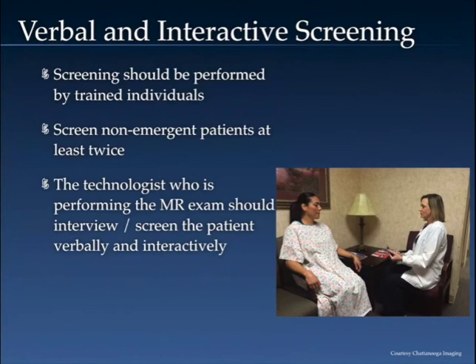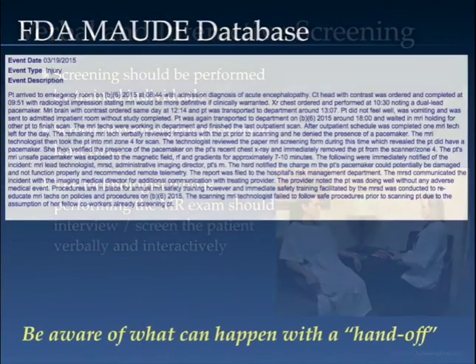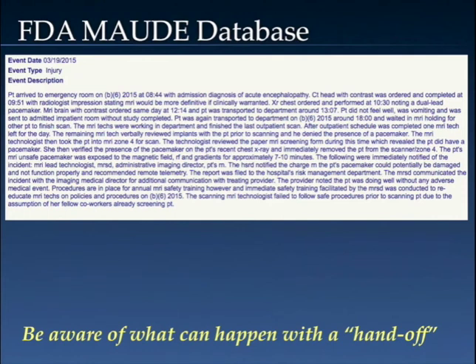And this also avoids issues that can occur with a handoff where someone else screens the patient and then another technologist performs the exam. In fact, here is an incident documented in the FDA's MAUDE database, event date 3/19/2015. And I realize this is rather busy verbiage here, but let me briefly explain what happened. Patient comes into the ER. They order a CT head with contrast, and the radiologist says, well, if it would help, an MR would be more clinically warranted. And at the same time, of course, they ordered a chest X-ray, did it about 10:30, and they noted on the chest X-ray a dual lead pacemaker. Well, then they turn around and, of course, order an MRI brain with contrast on the same day, around noon.